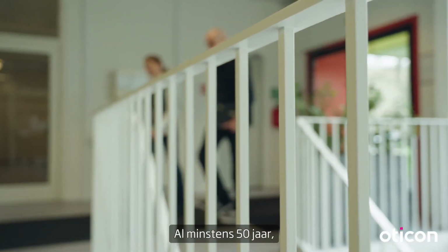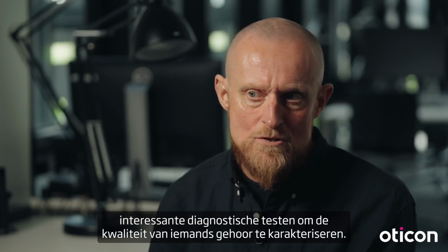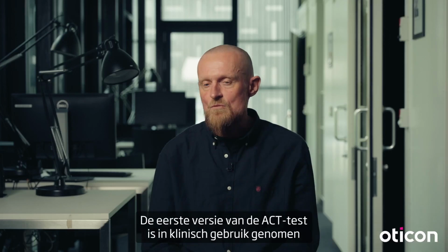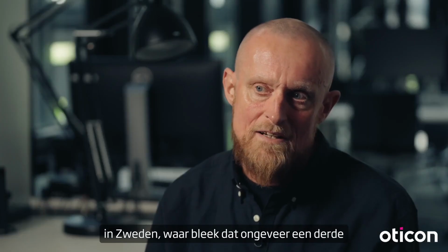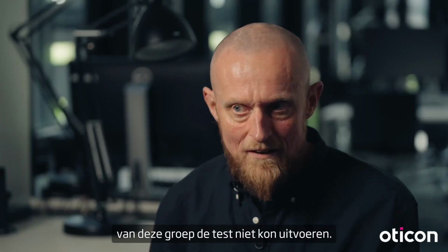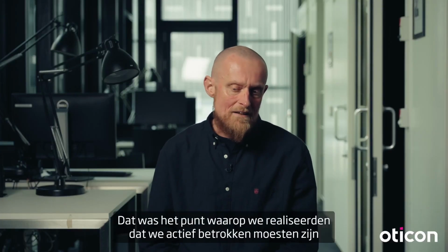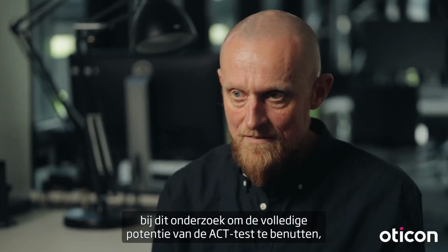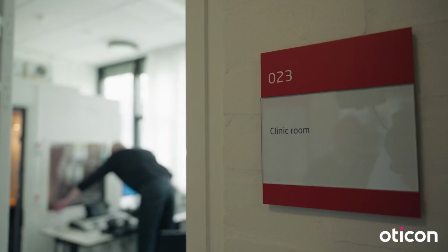At least for 50 years, researchers have been looking for interesting diagnostic tests to characterize the quality of somebody's hearing. So the early ACT test was taken into a clinical population in Sweden, where it turned out that about 1/3 of this regular clinical population couldn't do the test. It was simply too difficult for them. And this was where we realized, okay, we needed to be actively involved in this research in order to unleash the full potential of the ACT test, by making it clinically viable and doable by everybody.